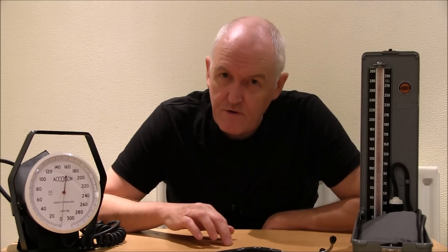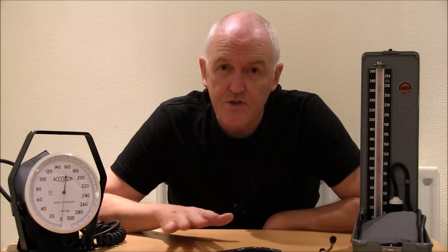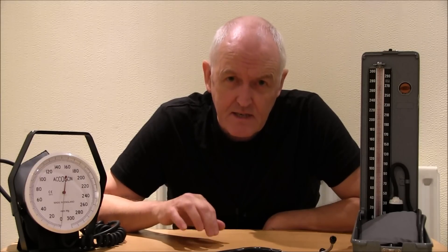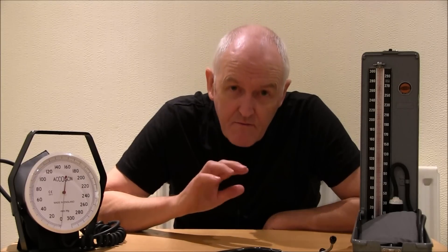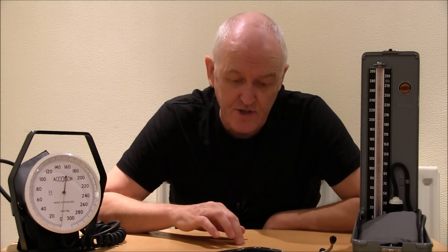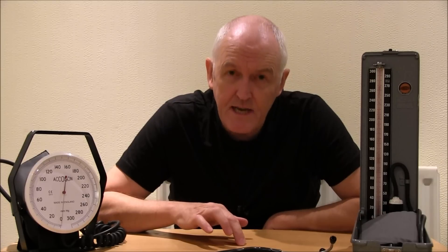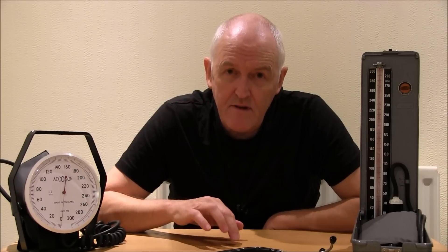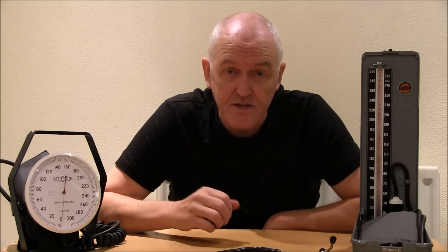The last sound that you can hear with your ears is the diastolic pressure. We used to teach that the first muffled sound was the diastolic pressure, but we now know this does not accurately represent the physiological situation. So what used to be called the diastolic dilemma is now over. The very last sound that you can hear is the diastolic pressure. So: very first sound — systolic; first muffled sound; very last faint sound — diastolic. Let's see this done in practice.